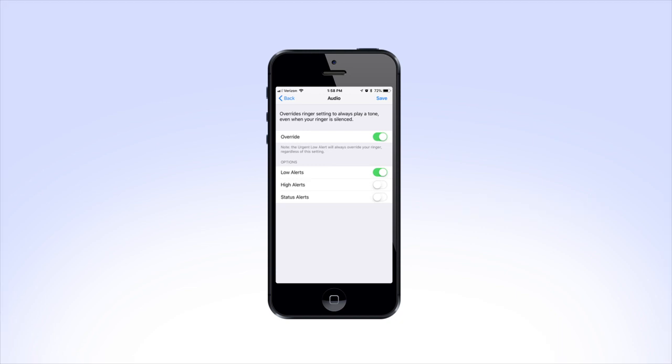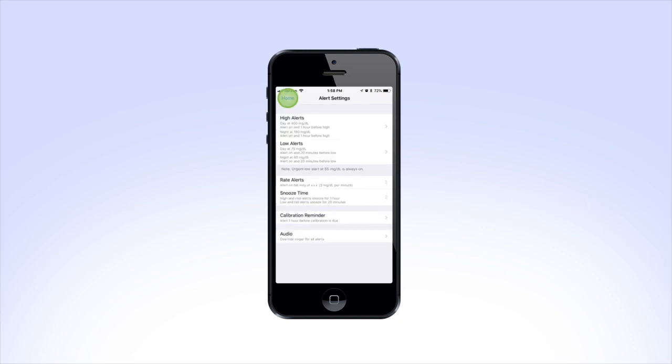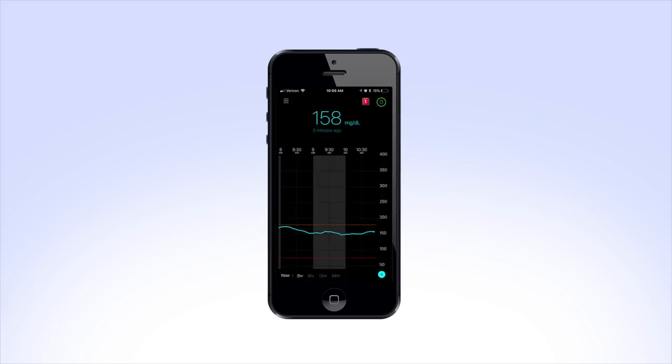To return to the home screen, tap Home. Now that you've set up your high and low limits, you'll see the limits you set appear on the graph. The low limit will be shown as a red line at the bottom of the graph, and the high limit will be shown as an orange line above it.